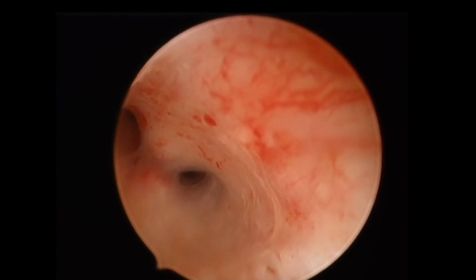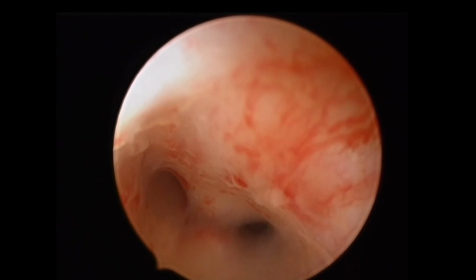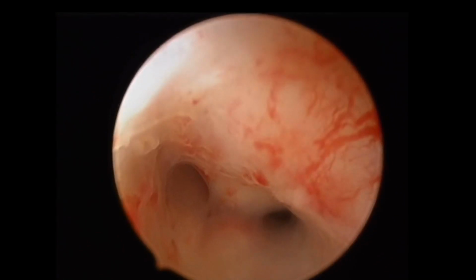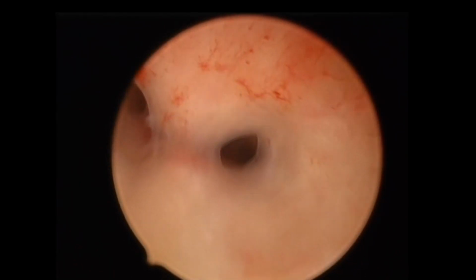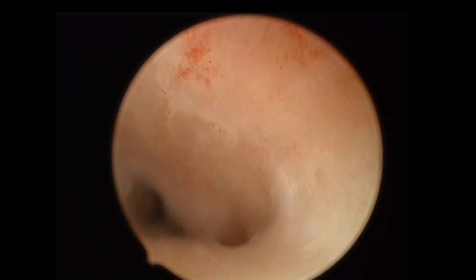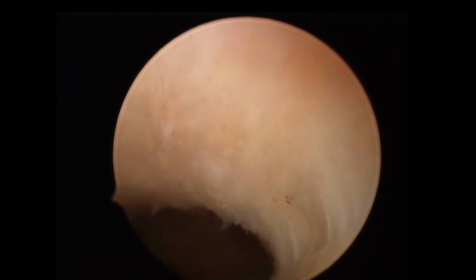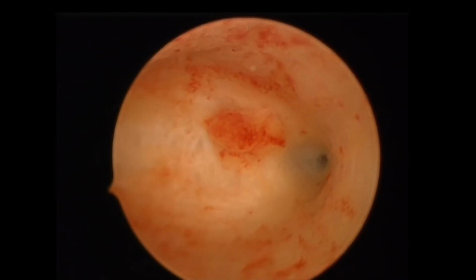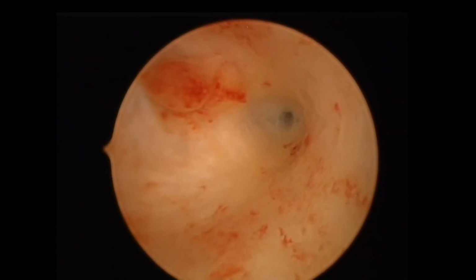Let us watch some nice techniques which make hysteroscopy a real pleasure. Sometimes there are adhesions at the level of the internal os which obstruct entering the cavity, whether by dilator or by the hysteroscopy sheath. And sometimes you go into a false track. Stand before the adhesions and use the fluid pressure to do hydrodissection and open the way gradually until you enter the cavity. And then we have the pathology inside, which is a small endometrial polyp.